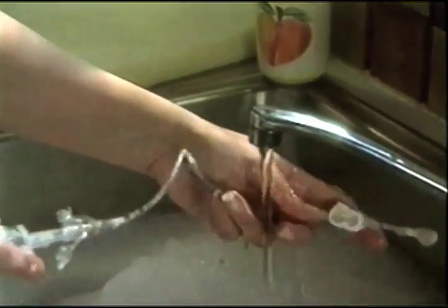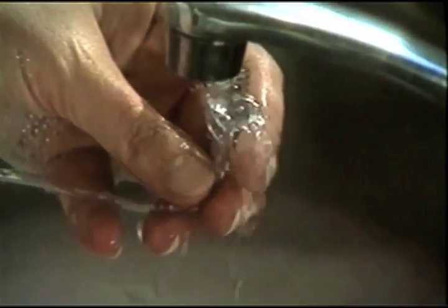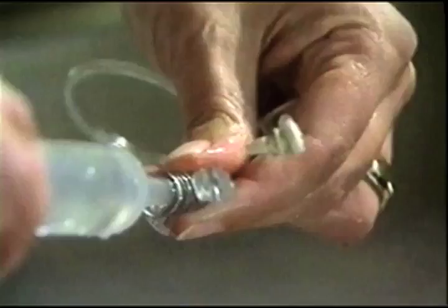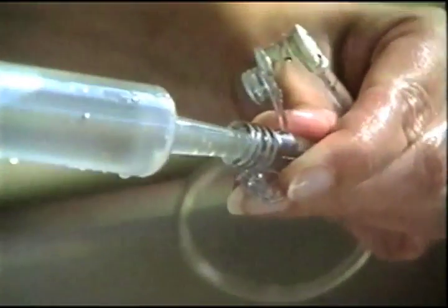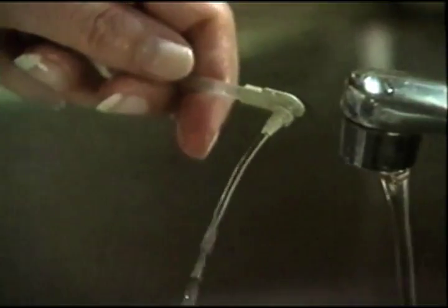Clean the extension set immediately after each use. Wash in warm, soapy water, rinse, and allow to air dry. For flushing the extension set, use the catheter-tipped syringe. When the extension set needs to be replaced, it is available from medical supply sources.